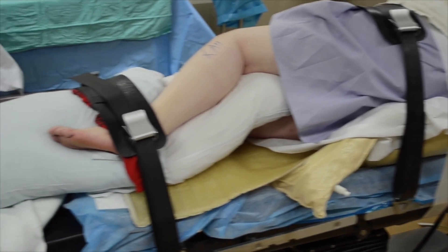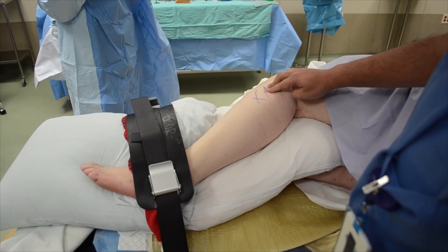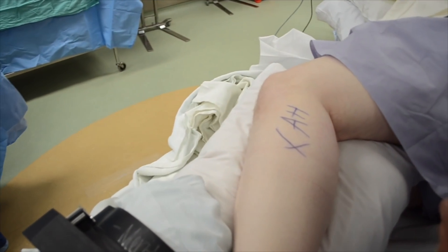The patient is positioned lateral on a beanbag with the operative side up. An axillary roll is put in place to protect the brachial plexus.